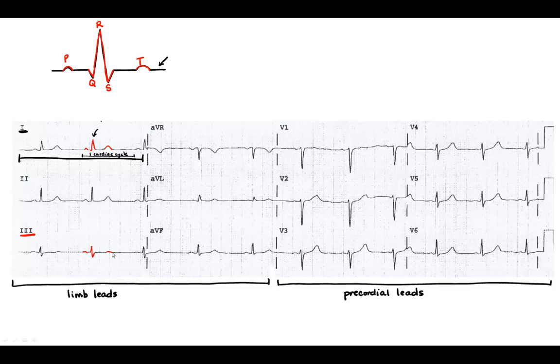Now there are a few, like AVR and V1 and perhaps even V2 in this diagram, that you look at and say, I'm not really seeing what I'm supposed to be seeing. And that's actually okay. It's just that various parts of the diagram are distorted. So let's say you were looking at V2 and you're thinking, how does this diagram match up to that one? And really the reason it looks so different from the textbook version is that the different humps, depressions, and peaks in V2 are actually distorted versions of what are found in the textbook diagram, but they're basically all still there.